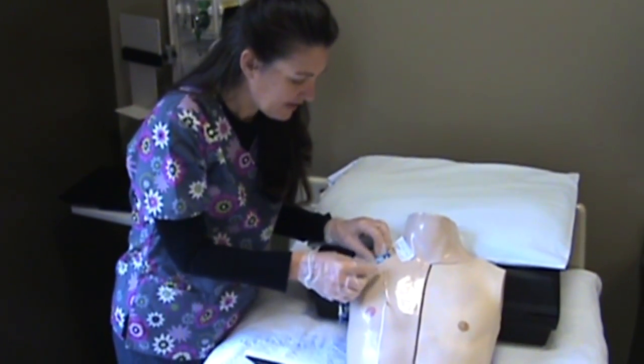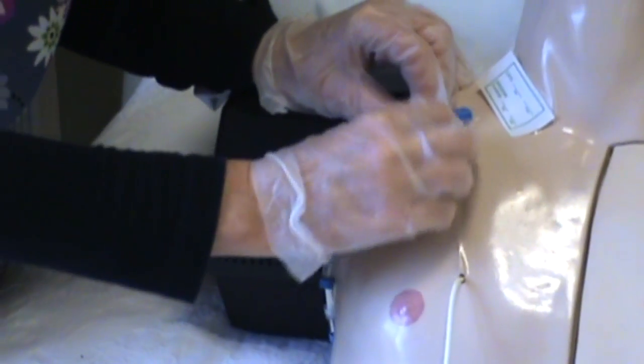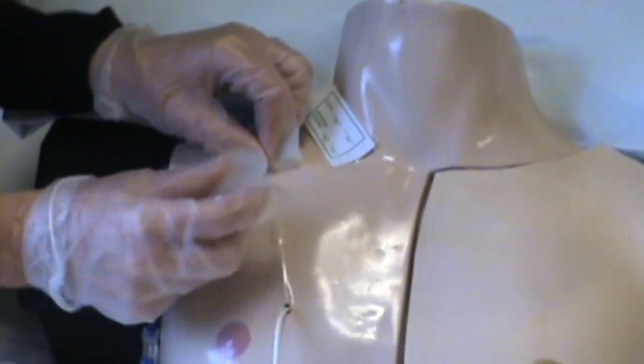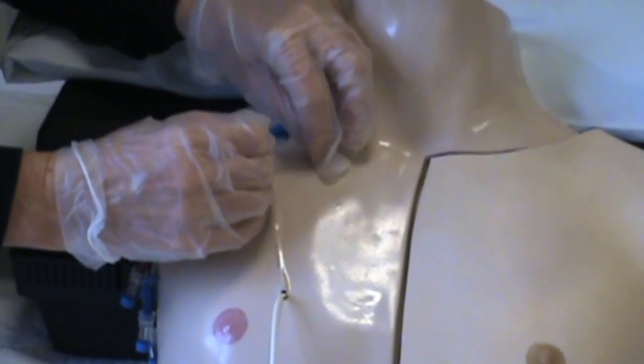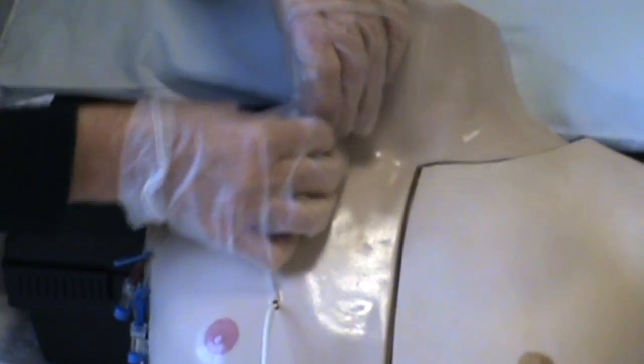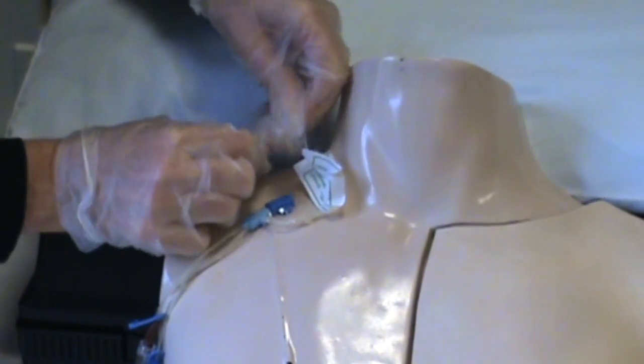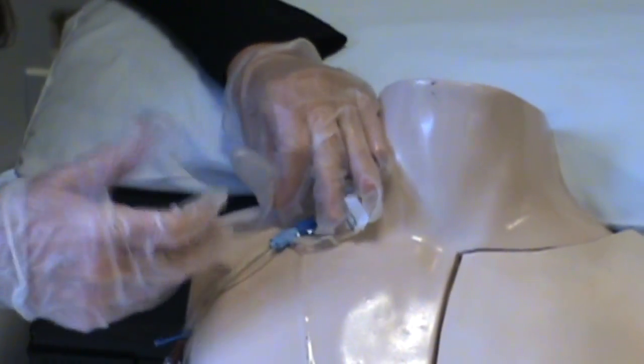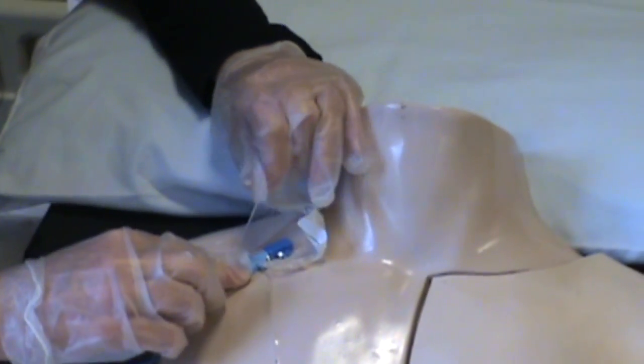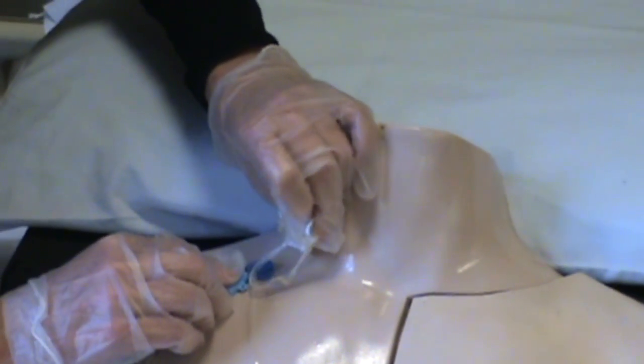You're going to take off your dressing from outer to inner, so I'm just going to get a hold of this dressing and pull it from the outside to the inner. You've got to be really careful when you get to the middle to stabilize it so you don't pull it out. Just stabilize it.